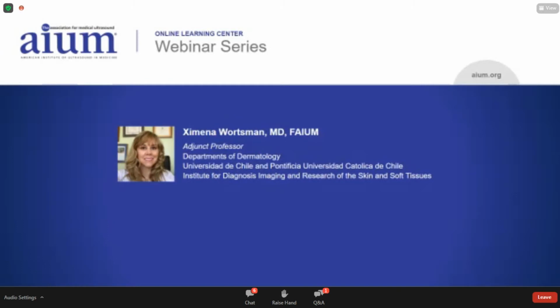There is another question. I understand that we cannot use ultrasound for diagnosing the lesion. So in general, in which situations do you encourage ultrasound? Well, I think I mentioned the top applications, and these applications that I mentioned are really daily practice for me. So I encourage using dermatological ultrasound in all these cases.